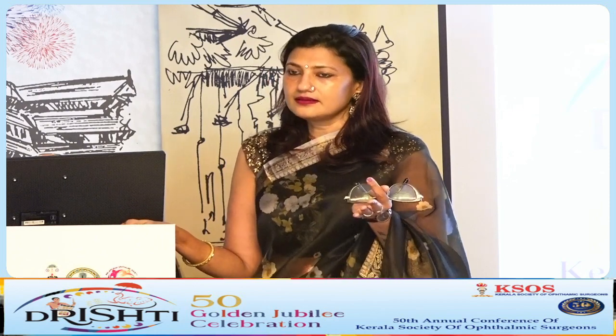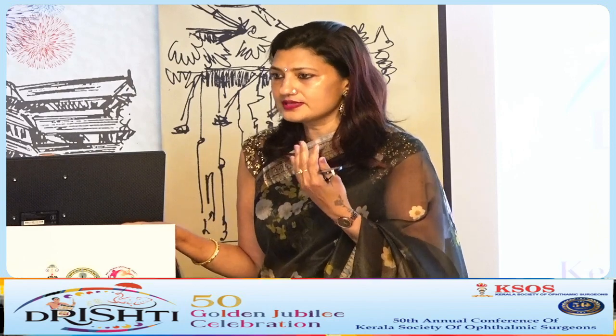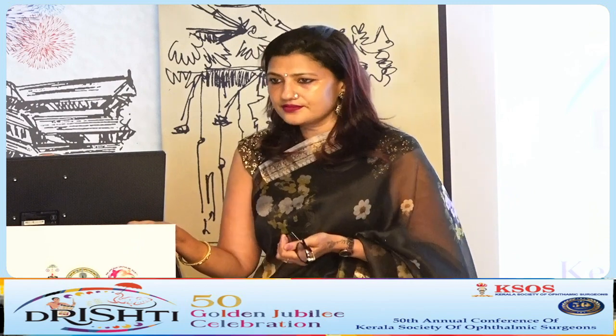But if you suspect ethambutol toxicity, before you label the patient, it is ideal that we do an MRI and a VEP also. MRI to rule out any other cause for optic nerve dysfunction, and VEP to record that there is definite optic nerve dysfunction.